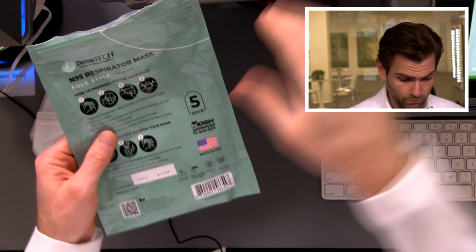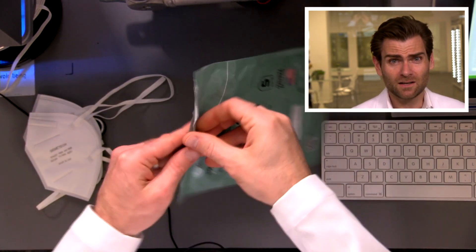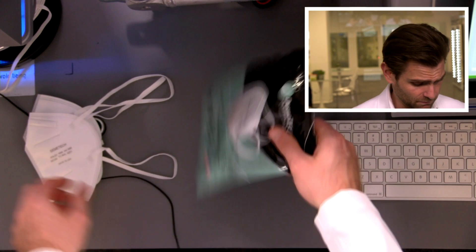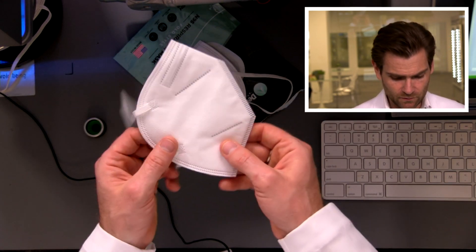All right, let's take a look at this. So it comes in this nice bag here, which I opened. It's nice, it's convenient — it's a resealable pouch. So you can put these in your fanny pack or something like that if you need to. It's got all the information and 'made in the USA' right there. This is after what's called the KN95 design, so it's going to look like that.